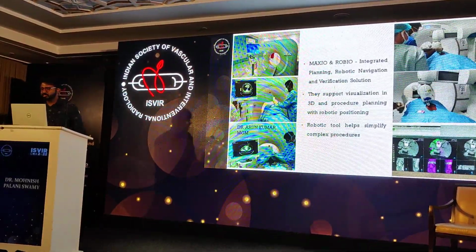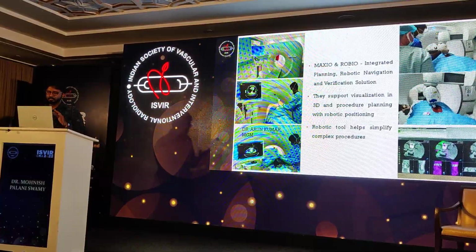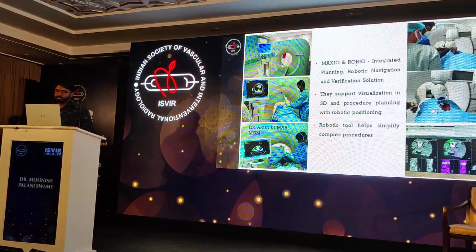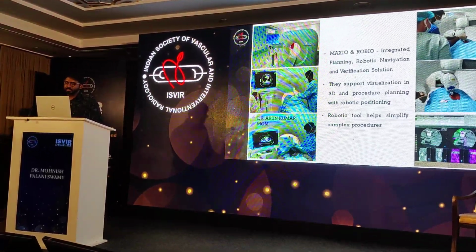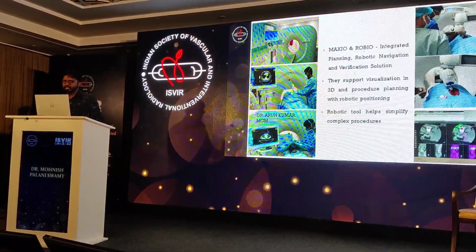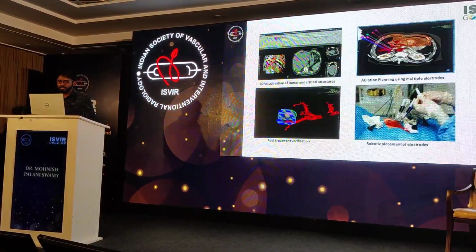This is me doing a procedure on the Maxio for a vertebral biopsy, although it was a teaching session for the fellows. The robotic arm comes and fixes in a position where you can push the needle into the lesion and take a biopsy from there. So it has its own benefits.